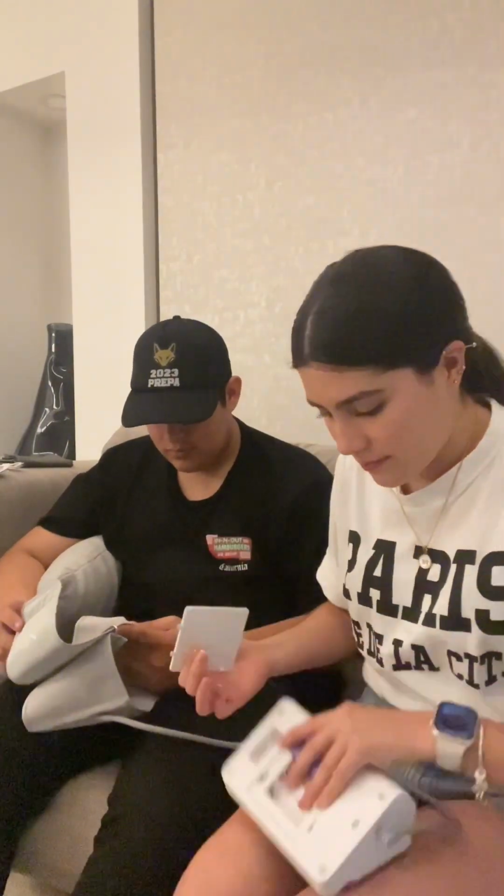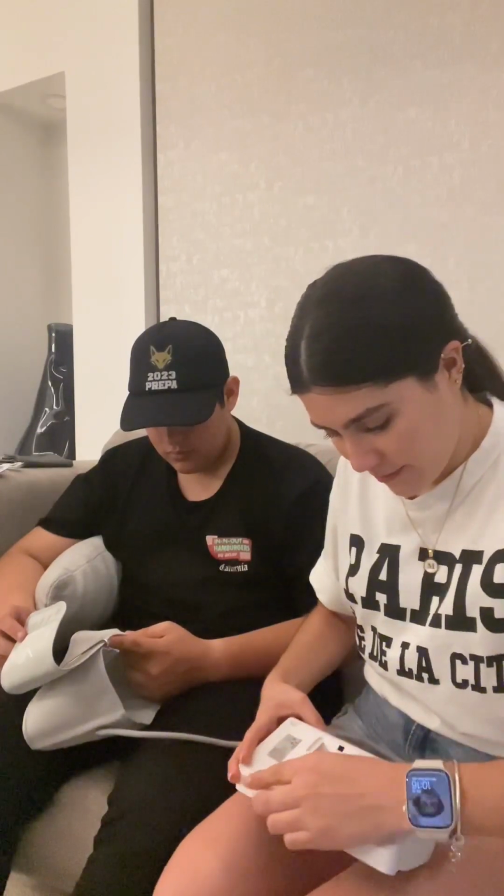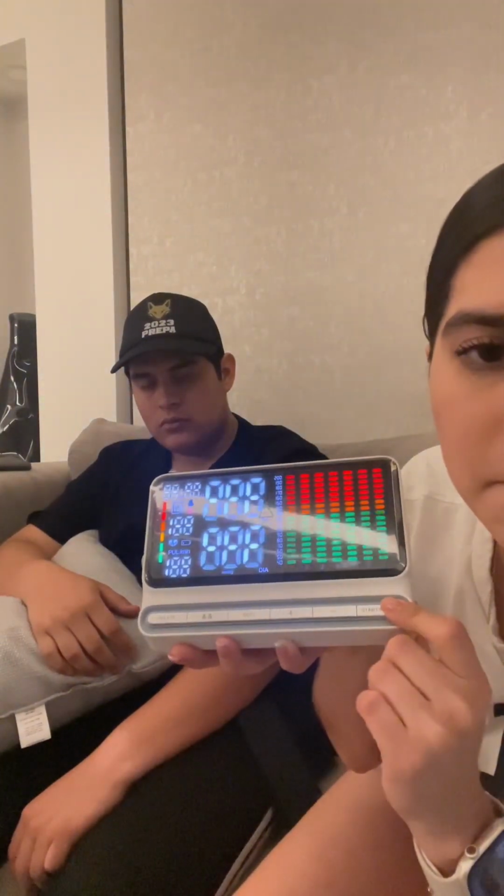Okay, here's the person who is going to help me to use the blood pressure monitor, and we are using the lithium battery. So we are going to close it. Once we put the cuff on the arm of the patient, we're going to put this in this part of the blood pressure monitor. And then we're going to press the start and stop button.